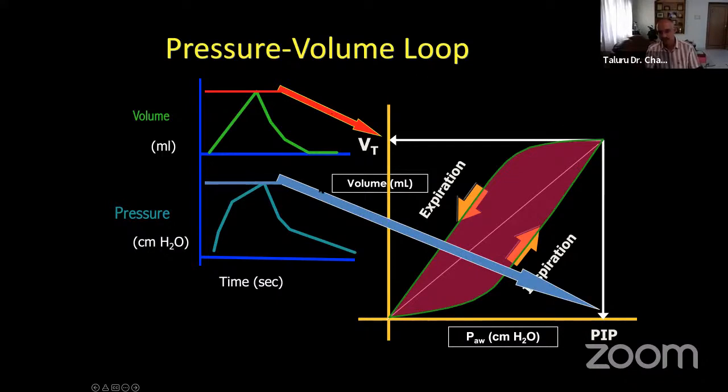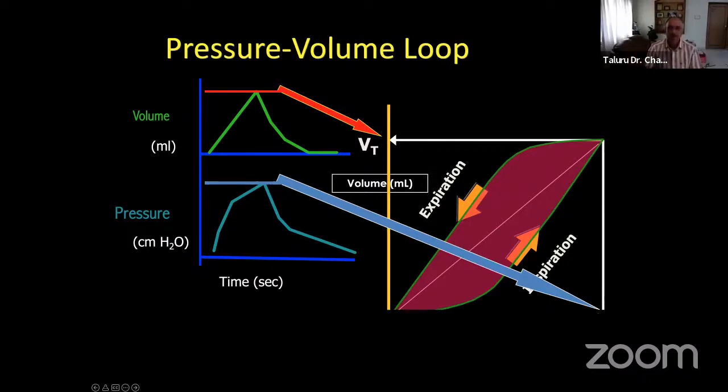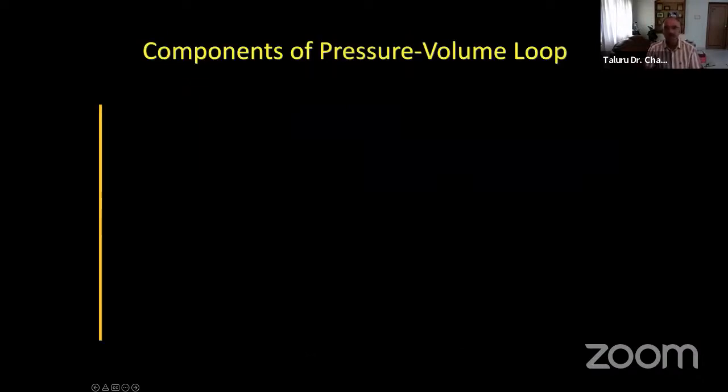The information which we have already learned, for example, if this doesn't come to zero, starts ending here only, that means this has not come here to zero. That means that is a leak. That is what you have to understand. We have already learned that. You just have to understand what is the x-axis and y-axis and bring the same information here. It is very, very, very easy to understand. It will take a little time, but you will get there. It's not difficult.